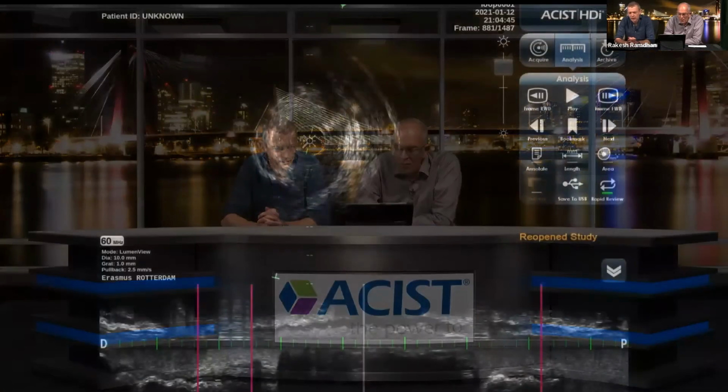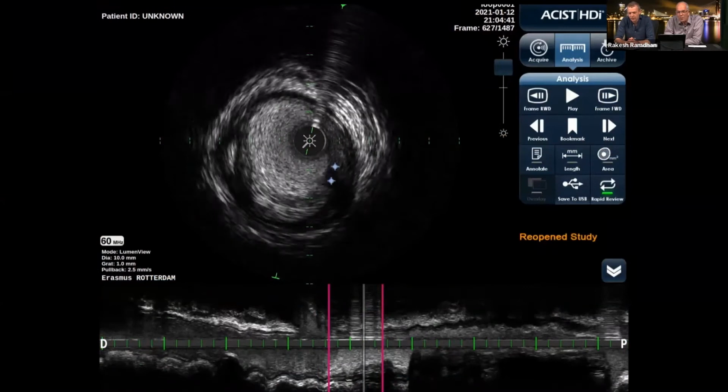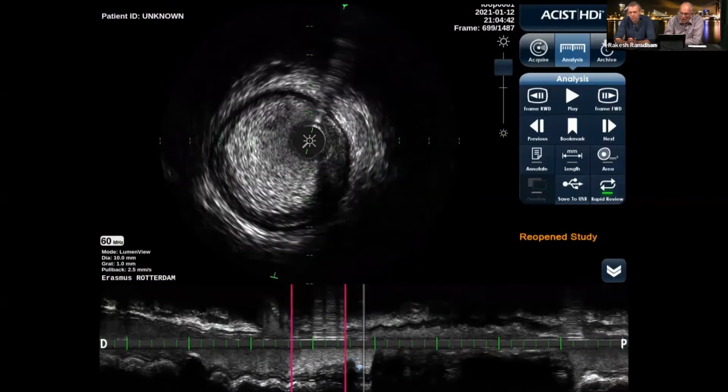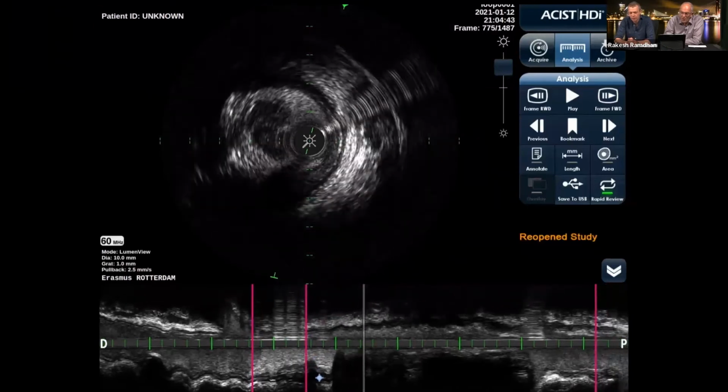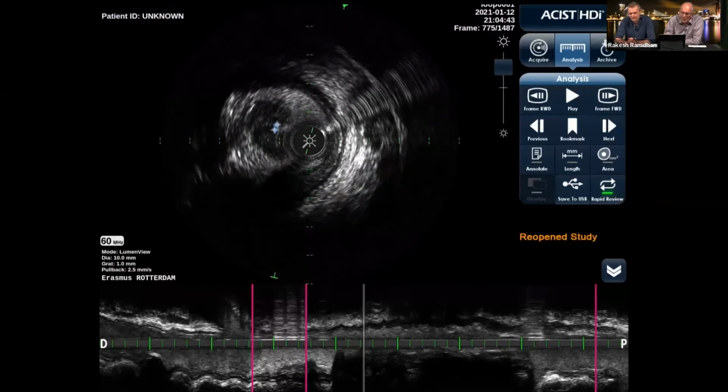So if you go briefly back to the IVUS, then this actually is derived from the part with the subacute thrombus, which is clear if you go a little bit more proximal. Here, see the thing that looks like organized thrombus. Well, the organized thrombus, you have to be careful. There is some drawing, there is reflection from it. And the organized thrombus, you actually never find swimming loose in the lumen. It's always attached to the wall and it stays there.